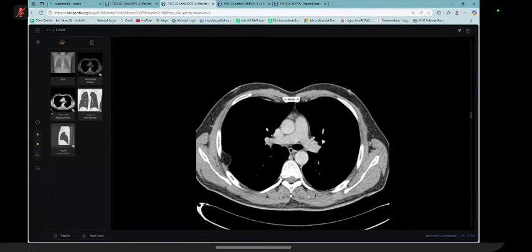So it may be a low-grade or benign lesion, but I do recommend MDT referral to decide what to do with this lesion further, whether to biopsy or not. They will decide what to do next, but you have stated all the pertinent negatives, that it is not aggressive.